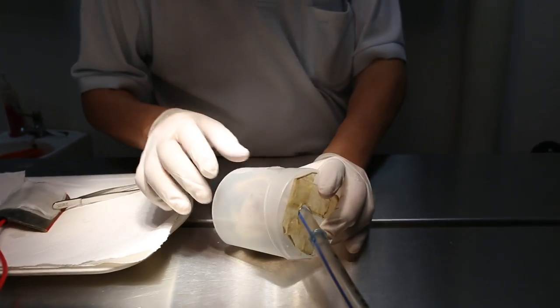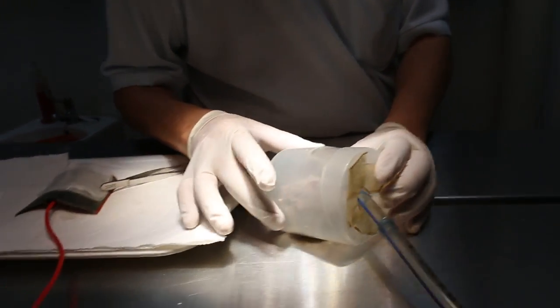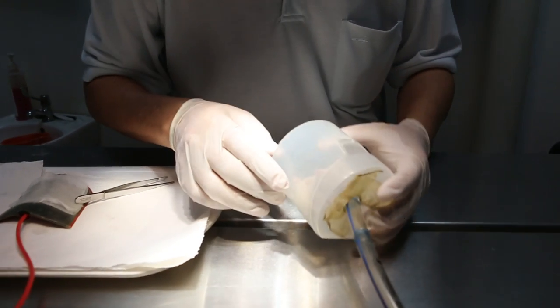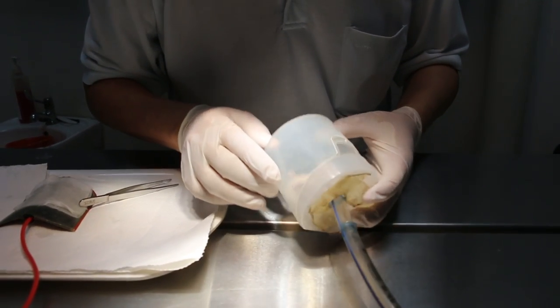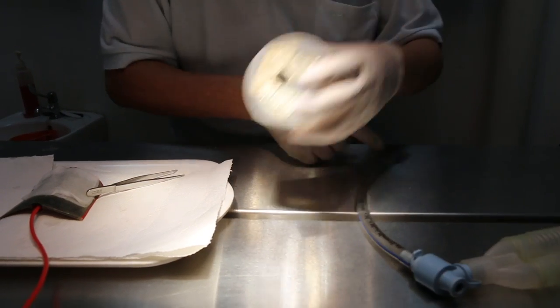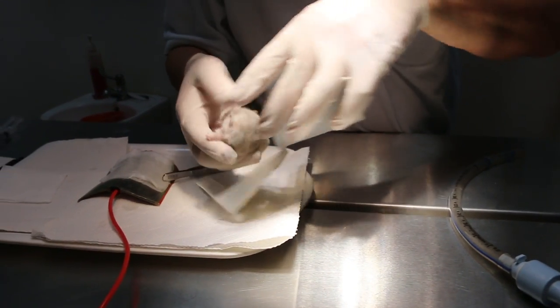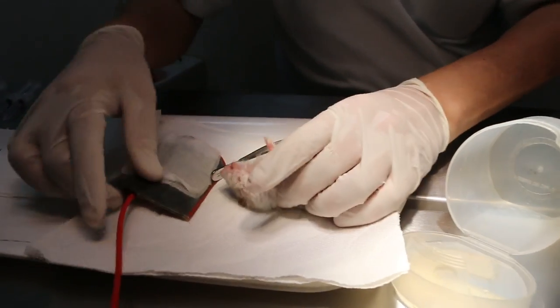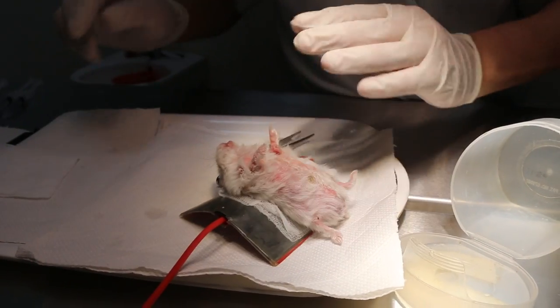On March 16, 2014, this hamster had an armpit wart. It's been anaesthetized with 5% isoflurane and oxygen. Now he's down already, in less than a minute. Not too long, otherwise he will die from overdose. So now he's down, you can see the wart is there. So I place him for electrosurgery.